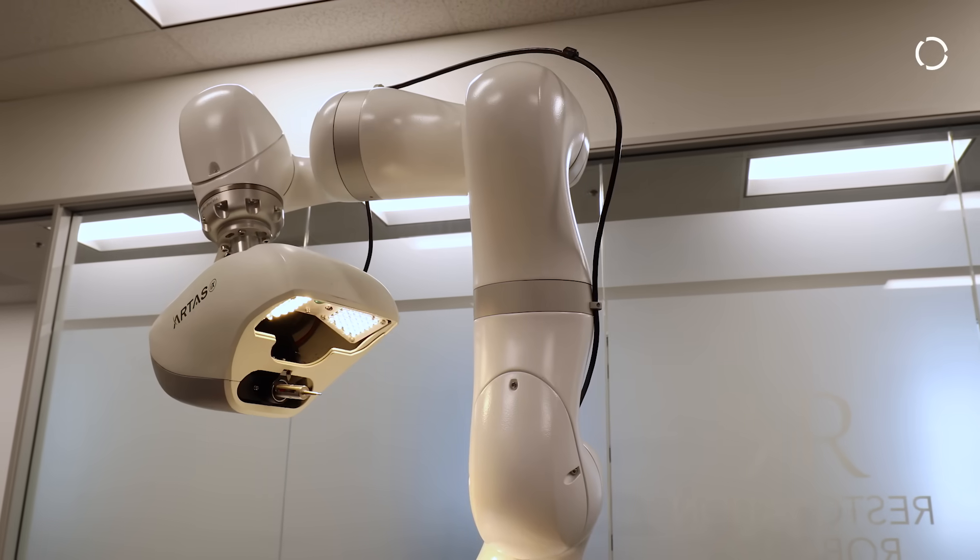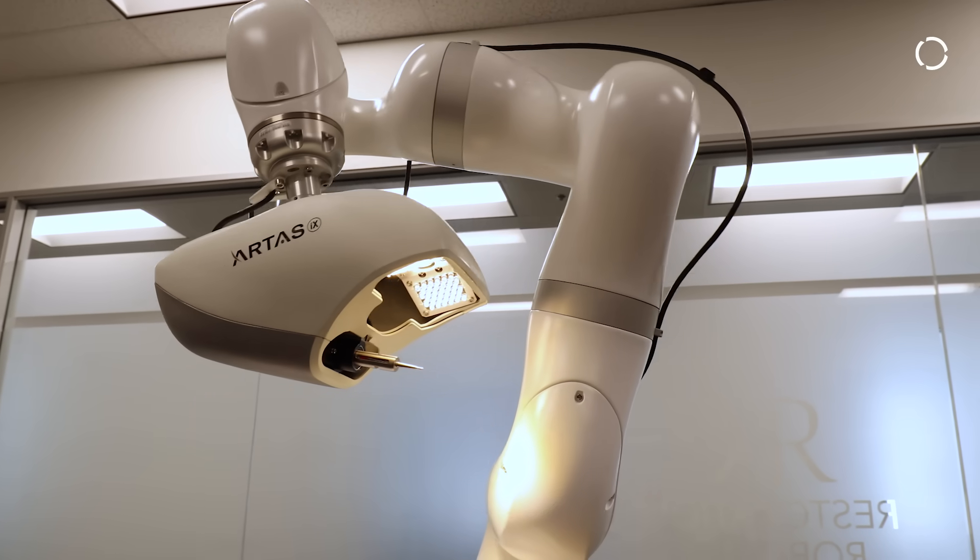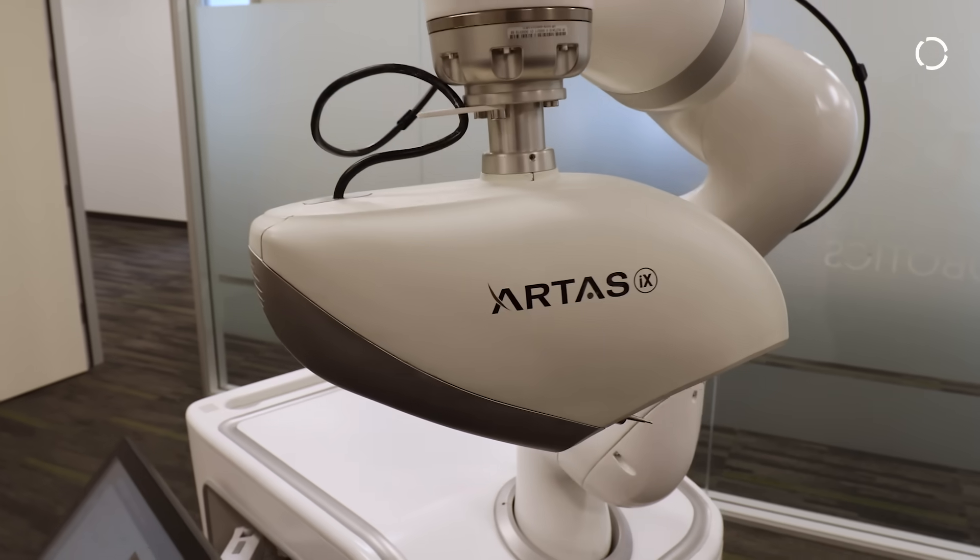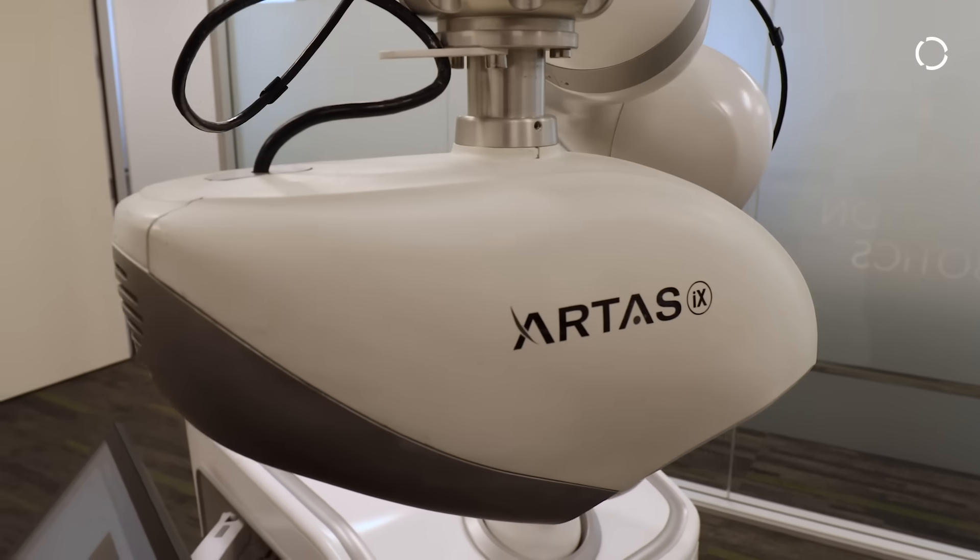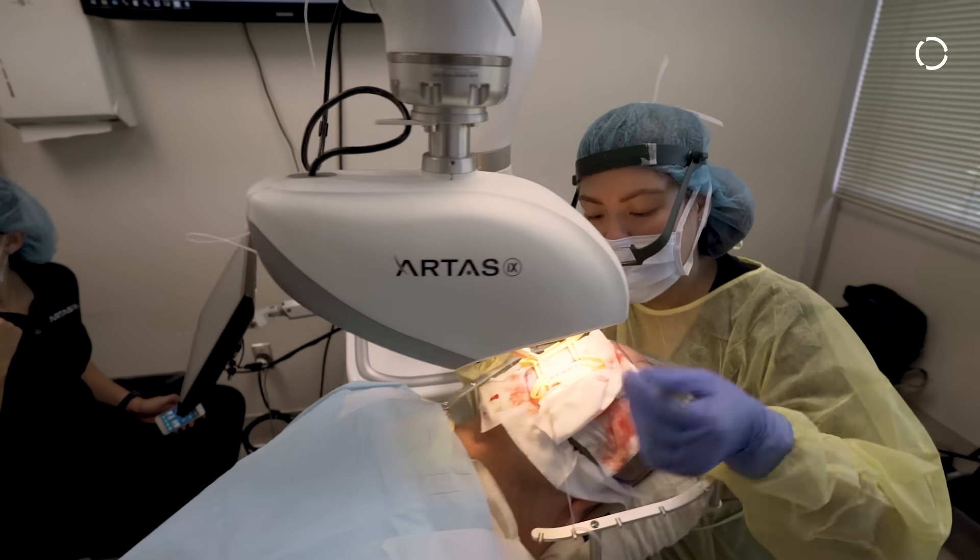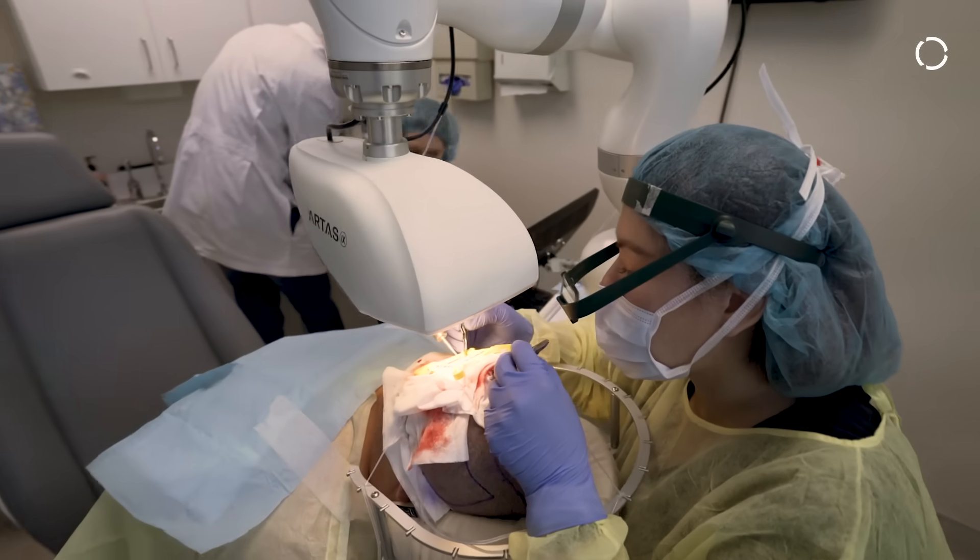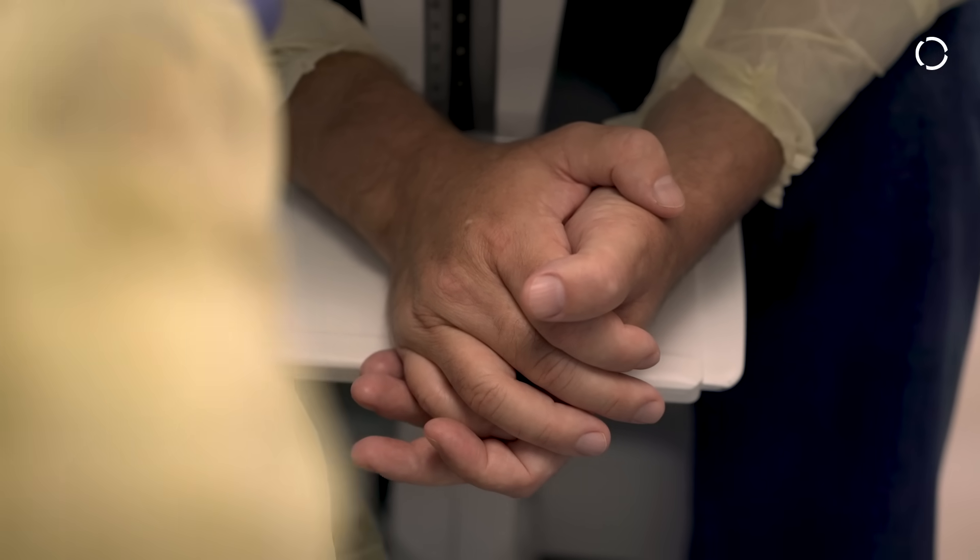The LBR Med is a platform, so it offers a lot of advantages and it was that platform that I've been seeking for many years. What it does is allow us to build a smaller system, allow us to make the patient more comfortable, and ultimately was the catalyst of what was Artis Ix today.